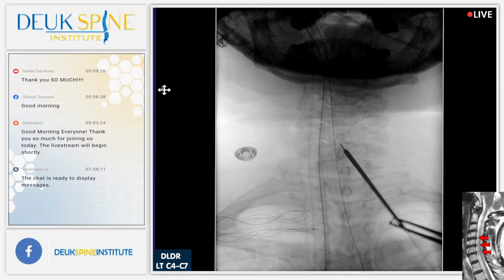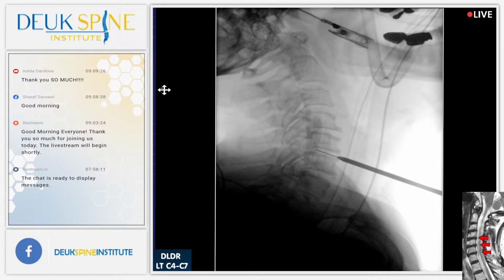One of the nice things about this surgery is it's bloodless. Literally, we're going to lose, that's 2 drops of blood we've lost so far. And we're almost done with our exposure. The exposure is the part, little bit of traction, the exposure is the part of the surgery where you lose the most blood.